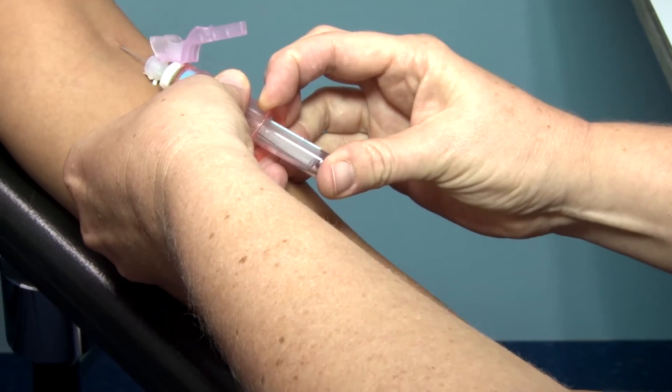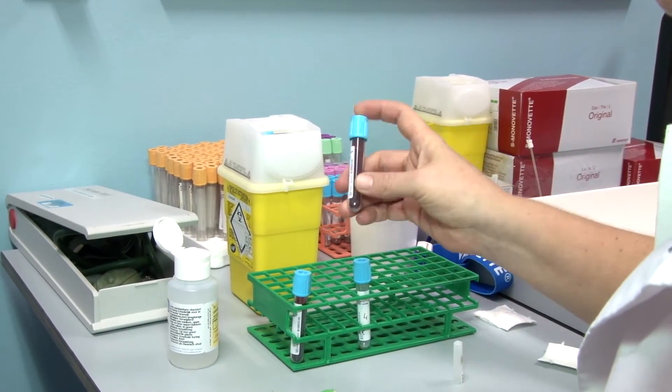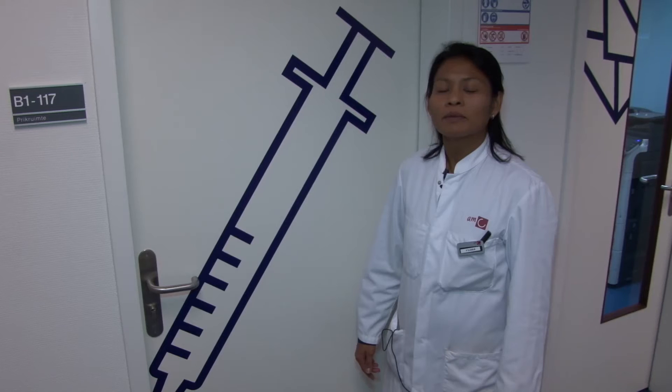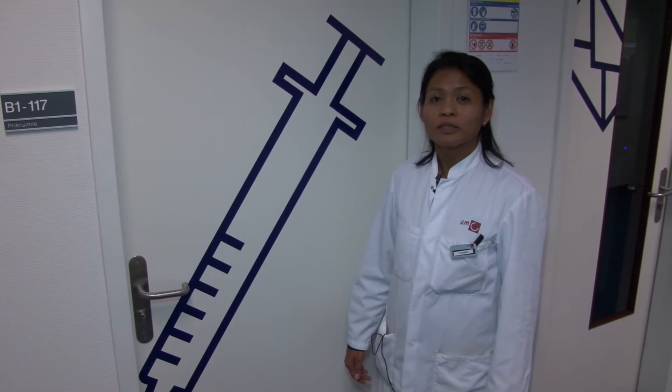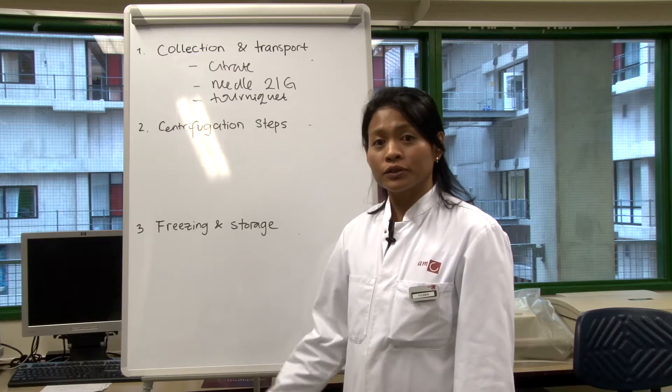The second tube will be used for collection of the plasma. The anticoagulant is mixed with the blood for at least five times. Please remember that the blood collection should be done on fasted individuals.